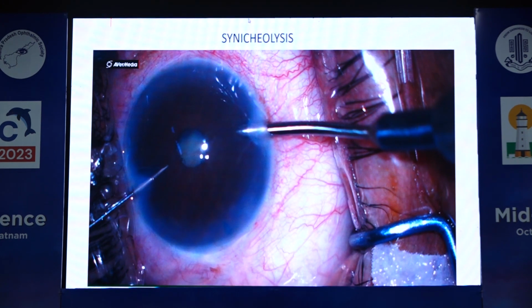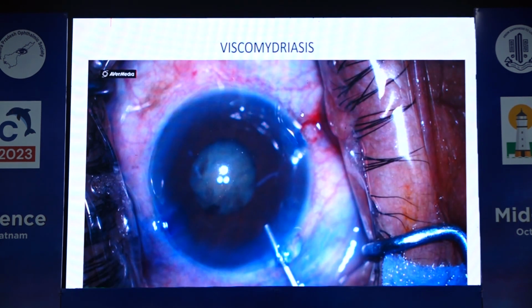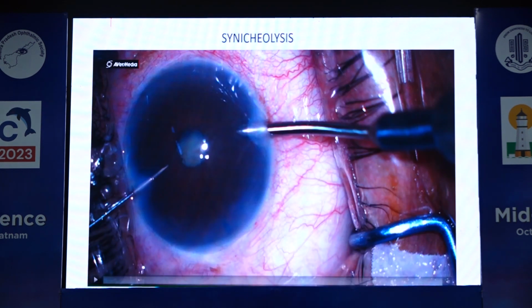So before doing a dilatation, it's important that you it's not playing.